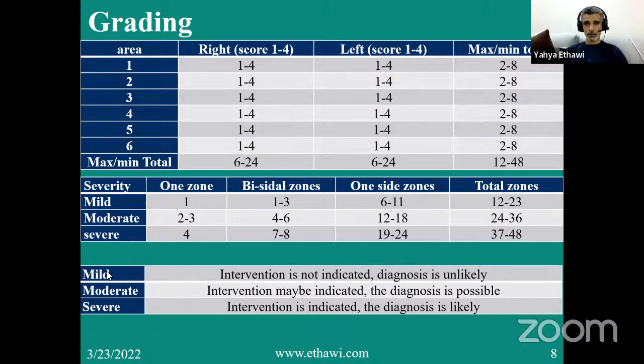Mild: the intervention is not indicated. Diagnosis is unlikely. So now I'm going to answer Dr. Shadid's question. He asked me maybe a few hours ago, what about surfactant? Well, here's the answer. Mild, you don't need it. The intervention is not indicated and diagnosis is unlikely. If it's moderate, the intervention may be indicated, the diagnosis is possible. Now, if it's severe, the intervention is indicated and the diagnosis is likely.